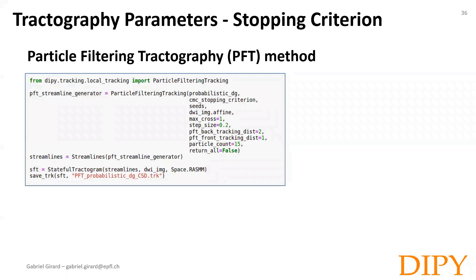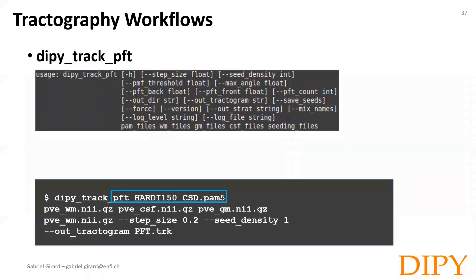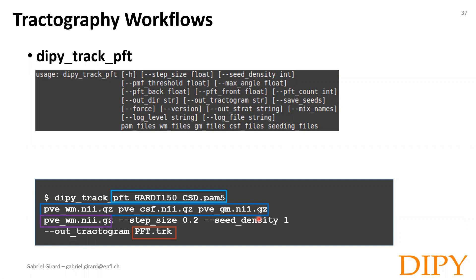To do this in DIPY, we need to replace the local tracking function with the particle filtering tracking function. It takes as input the direction getter — here for instance the probabilistic direction getter — a CMC or ACT stopping criteria that contains the partial volume estimate information, and the seeds. We can then generate the streamlines as we did previously. In a very similar fashion, we can perform the particle filtering tractography algorithm in the terminal using the DIPY workflows. The main difference is that we input the three partial volume estimates instead of the tracking mask.